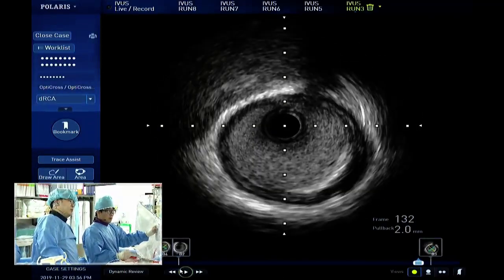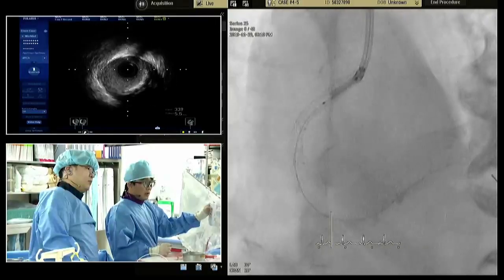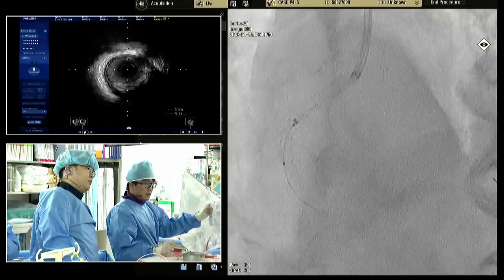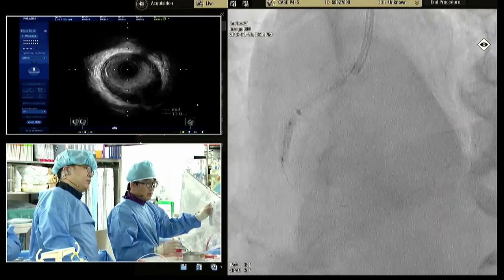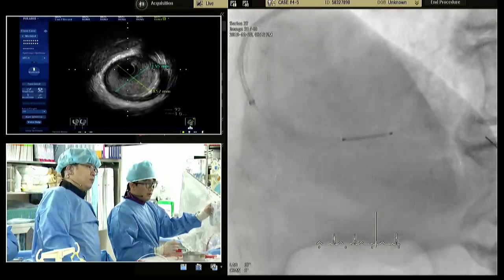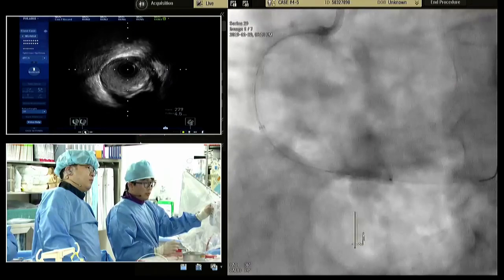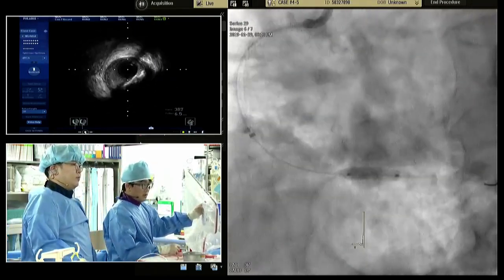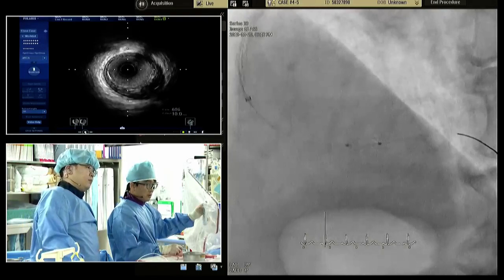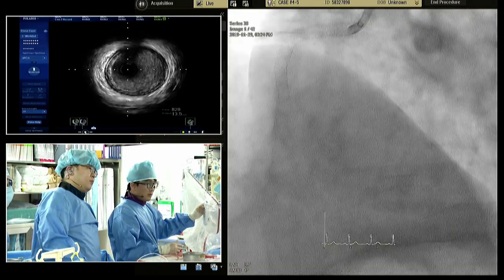So I selected to do short stenting with a pre-balloon here, and then I used a Guideliner to advance and overcome the proximal stent. I positioned the Guideliner distal to the proximal stented lesion and advanced it with a balloon-assisted technique like this. After viewing in multiple views, I used a 3.5 by 12 millimeter Synergy stent. And then I used a 3.75 high pressure balloon. Still underexpanded. Yeah, still diseased. There's lots of disease at the distal.